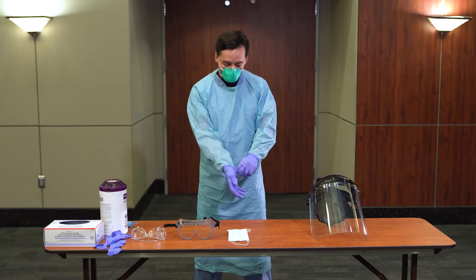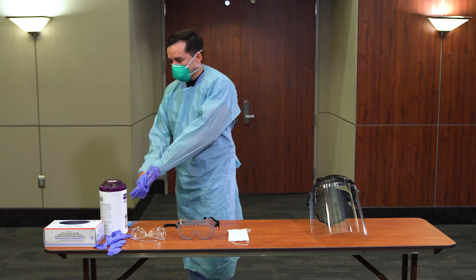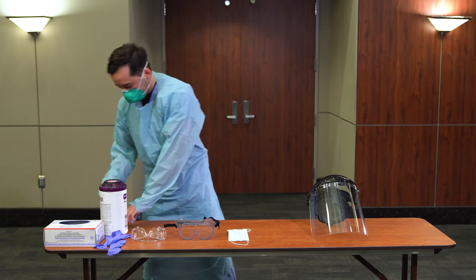Doff gloves using glove-to-glove, skin-to-skin technique. Perform hand hygiene and don new gloves.